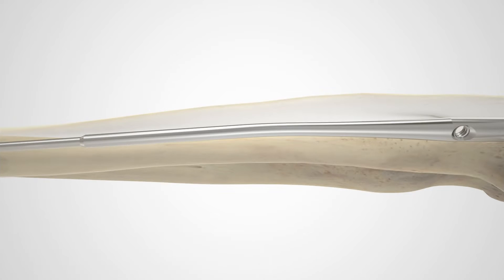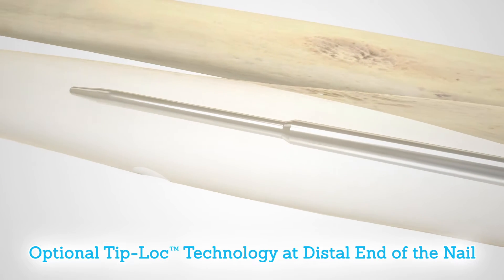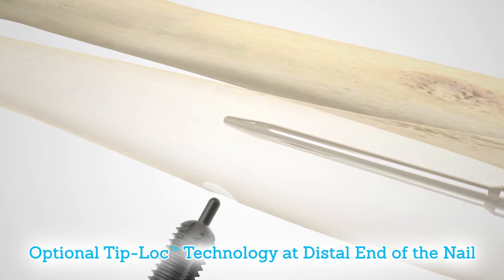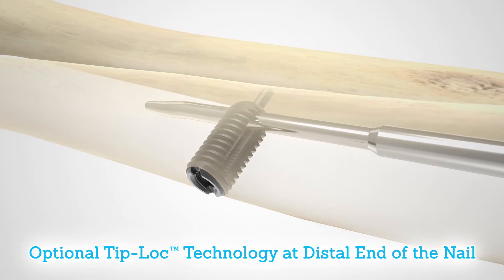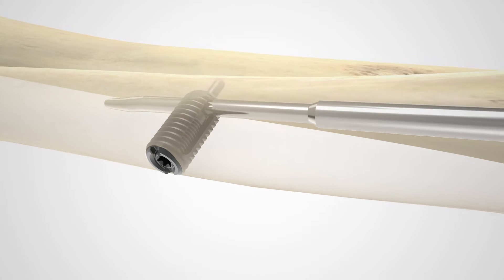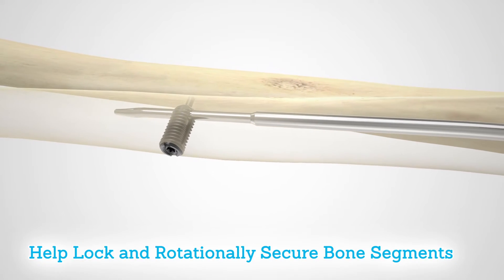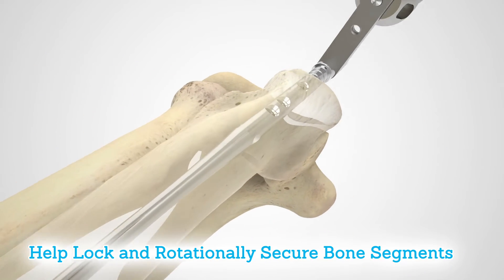Acumed's tip-lock technology has been implemented as an option in both the fibula and ulna nails of this system. This technology offers the option of a set screw and bushing at the distal end of the ulna nail. This combination and additional screws at the proximal end of the nail help lock and rotationally secure bone segments to assist in fracture union.